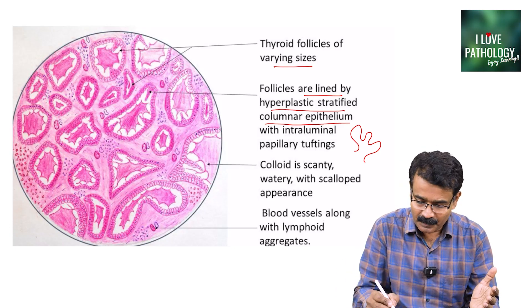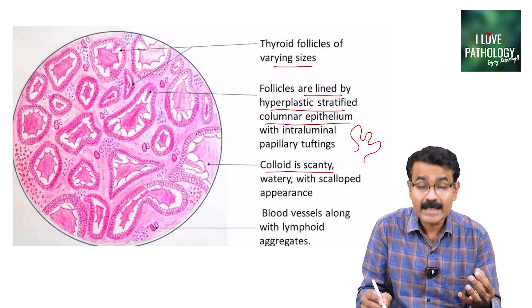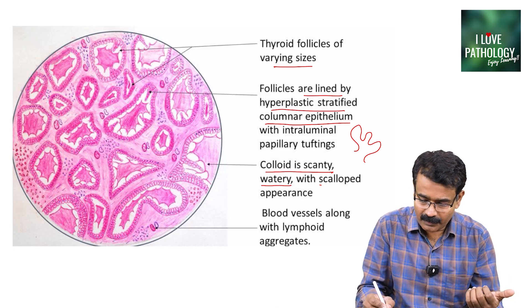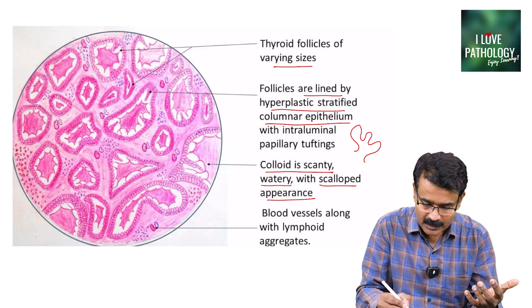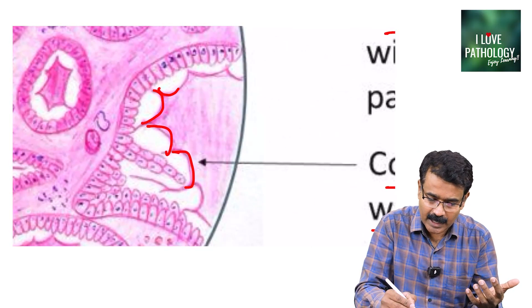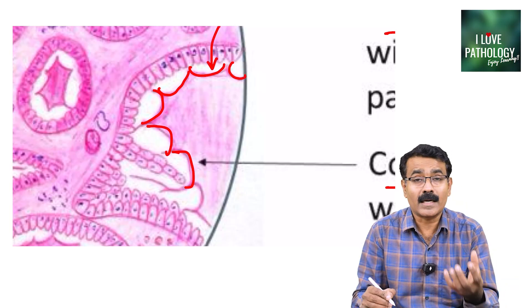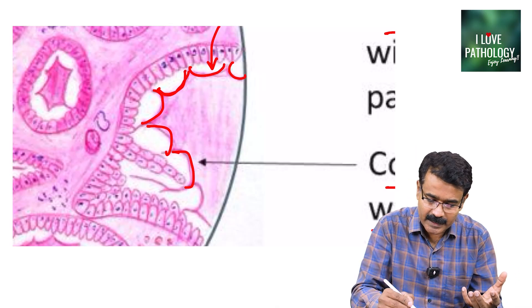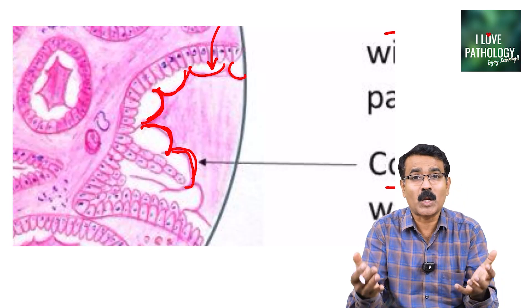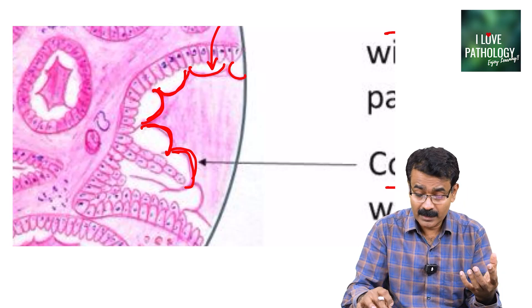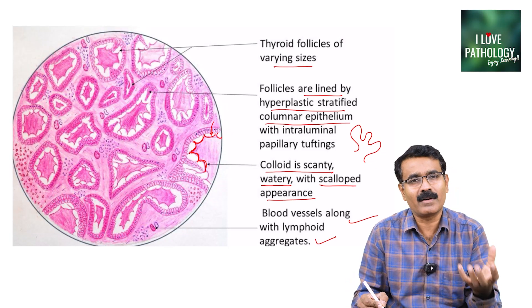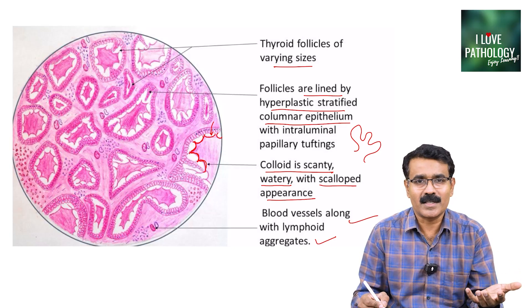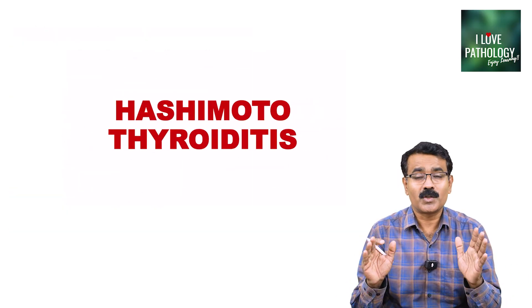The colloid is scanty because all the thyroglobulin in the colloid is used up. You can find a scalloped appearance at the edges of the colloid in the lumen — this is scalloping, because the hyperplastic thyroid epithelium utilizes the thyroglobulin for thyroxine production. The scalloped margins of colloid are a very characteristic feature of hyperplastic toxic goiter. You can also find lymphocytes and plasma cells in the stroma, since Graves disease is an autoimmune disease.